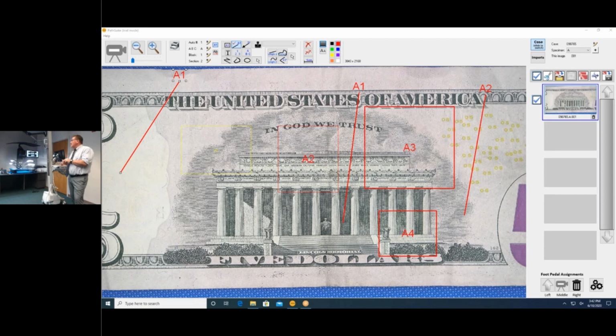We have some battery operation. You plug it in. It's got some switches and it gives you basically a warning when you're low. Like right now, we've been running, I'm still at over 90%. We've been running for the last 2 to 3 hours.